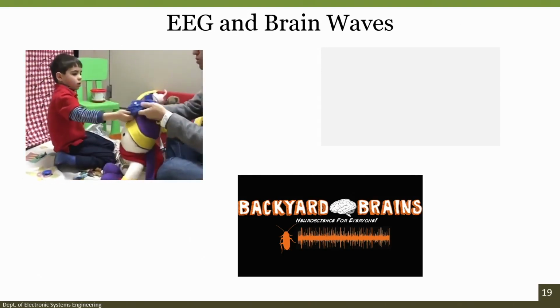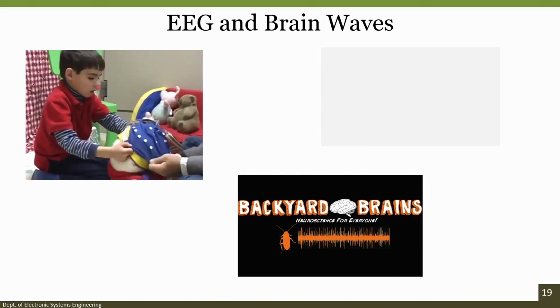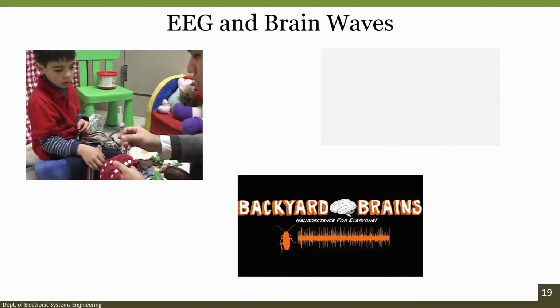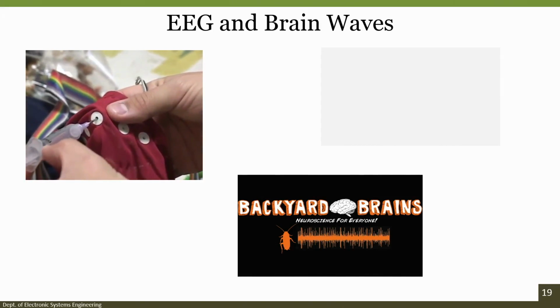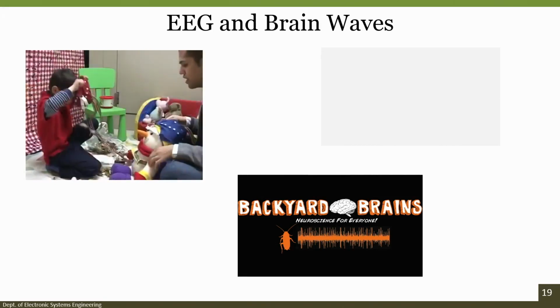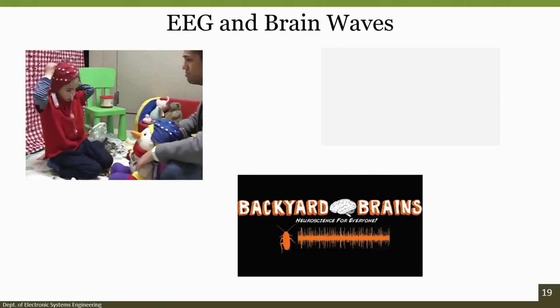While you play, Nate will show you the caps that you will wear during the study. They are stretchy and have lots of little holes in them. He will show you the syringe that he will use to help him get the cap ready. It looks like something that you might get a shot with, but it's not sharp at all and it won't hurt you. It's only used to put some sticky gel into the holes in the cap.